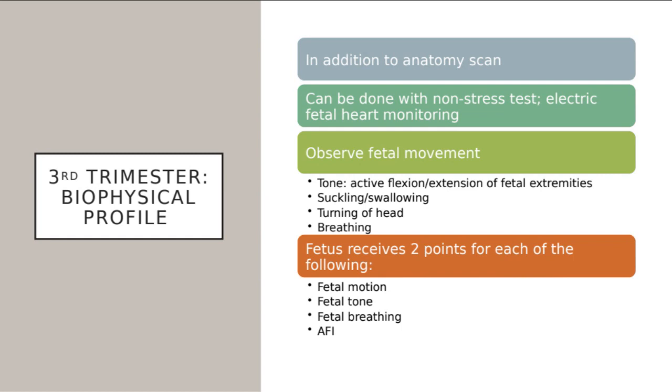So this is something that we get a little bit more concerned with, and depending on how the baby does on this exam, we could deliver early to get that baby out. These ultrasound evaluations are usually done with a non-stress test. A non-stress test is where they put little electrodes on your belly and monitor the fetal heart. You'll go for your ultrasound and then go for your non-stress test, or vice versa.